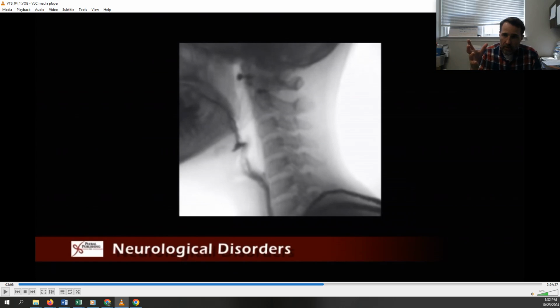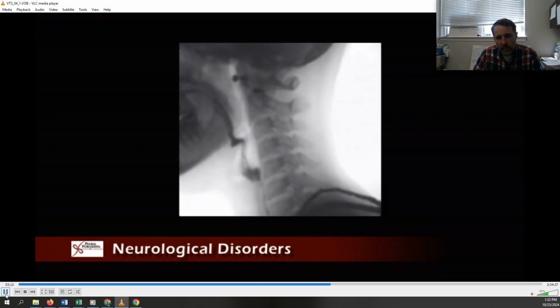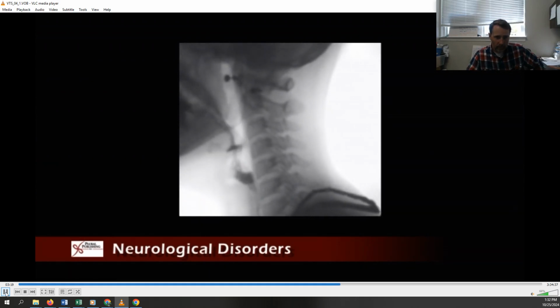The pharyngeal swallow, we know it's happening because there's a slight squeeze, but like I said, nothing is squeezing in tight. The airway is being left wide open due to a weak pharyngeal peristaltic motion. She's not getting much into the UES. Swallows are elicited to clear the pharyngeal residue, although it must be noted that she reports she does not sense any residue in the pharynx when asked.